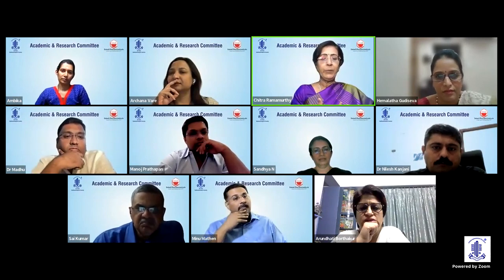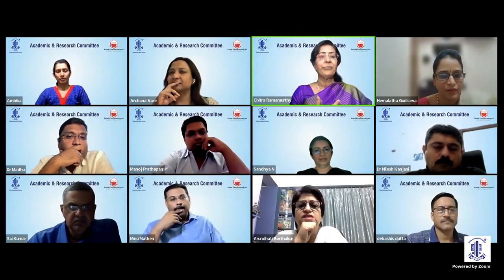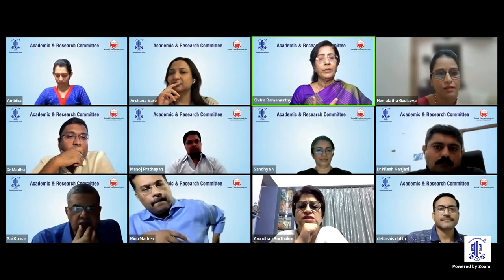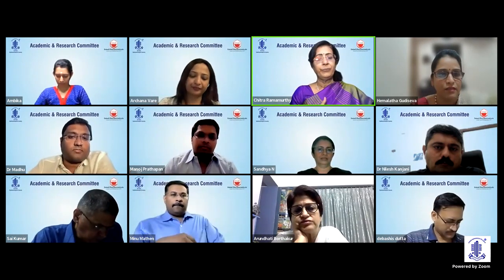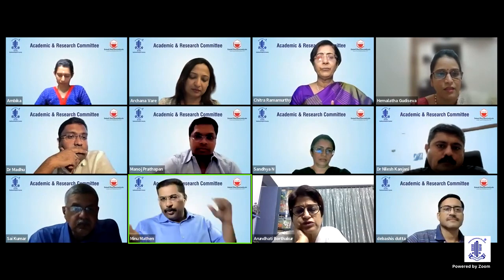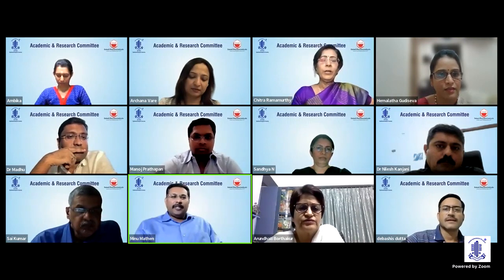It just came up to my mind. I hadn't noticed, unless Hemlata has something to add herself about this. I mean, you have not put a toric IOL in this eye. So by removing the lens, was there more of a lenticular astigmatism in this eye, or what? Topo itself showed 5 or 6. Sometimes patients don't accept so much, 6.5 cylinder. Sometimes it's just that the patient doesn't accept.